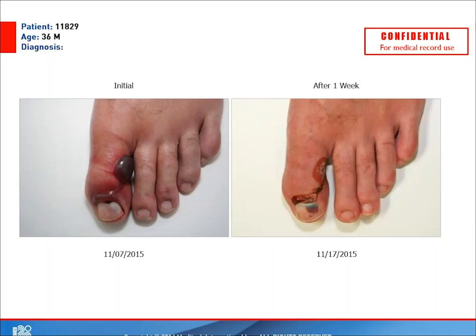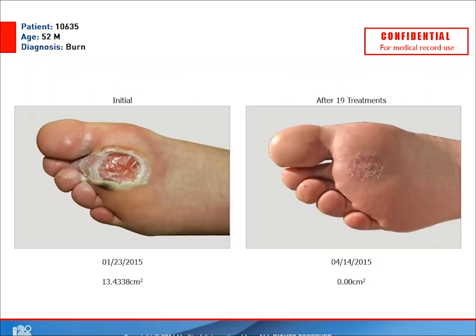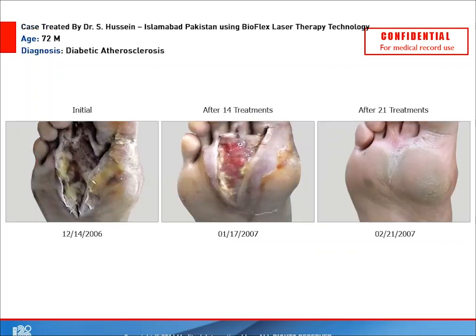Another case of wound healing, lower extremities, as a result of trauma, a crushing injury with a certain degree of ischemia, and you see how badly the great toe was injured. And you see the final picture of complete recovery and healing. Thermal burn, the sole of a foot. Again, it is difficult to treat and to heal those areas because patients have to walk, they have to step on that area. It's a weight-bearing segment of the body. So it is always difficult to prevent any further mechanical irritation and trauma. Nevertheless, the patient was healed nicely.